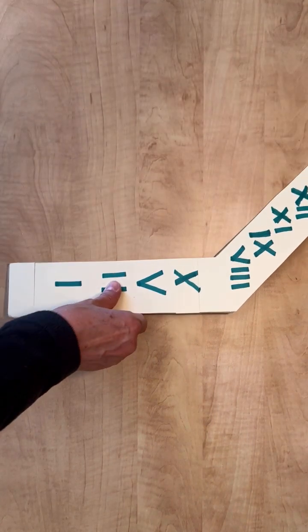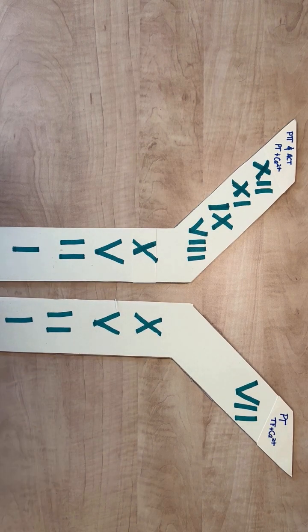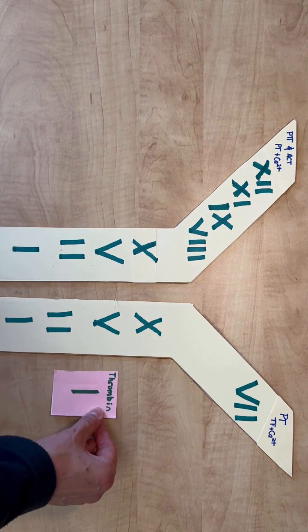The next set of tests we do are on secondary hemostasis. These tests assess whether the coagulation cascade is functioning, and the culmination of all of these tests is whether they can form cross-linked fibrin. We separate the intrinsic from the extrinsic factor pathway, artificially in the laboratory, by adding different reagents to 3 separate test tubes of blood.